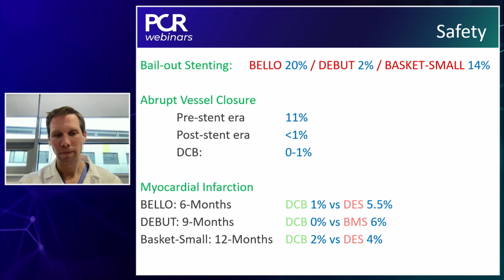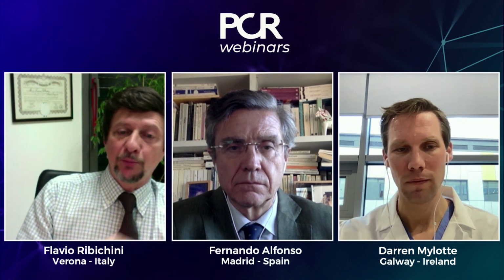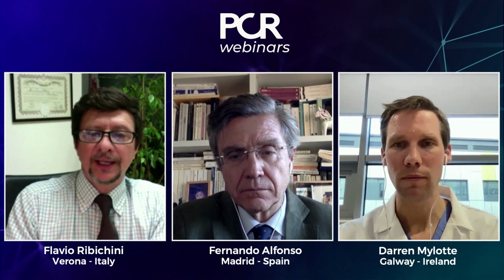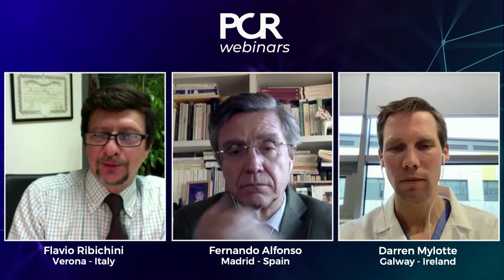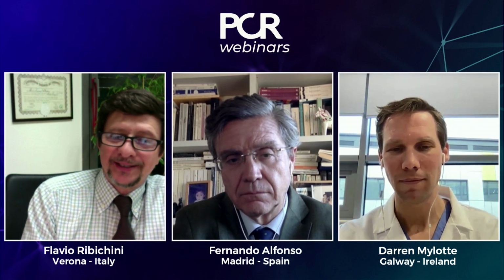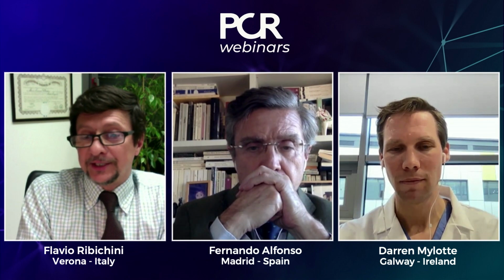Thank you. I mean, these data are impressive. It's not in our mind when we are in the lab. Certainly, we never imagine that it might be safer to leave a lesion without a stent rather than stenting, because what we get is the visual impression of a perfect result compared to that ugly dissection that you showed us before. So it's a little bit like accepting a bitter sip to enjoy the sweet of this sip in the long term. But of course, this is what we are discussing.